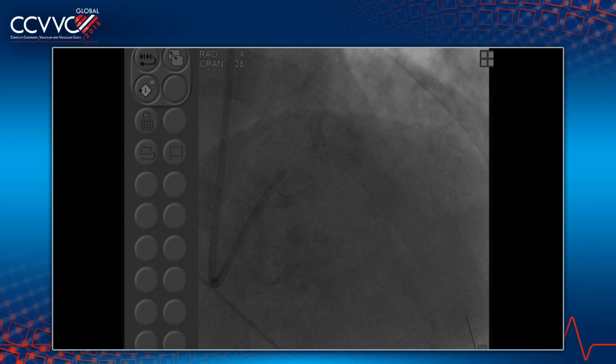And usually in the left main, we will say when you want to post dilate, go with your NC balloons. Any other comments about the case, Eberhard? Would you do anything differently, or would you like the mini crush, Dr. Colombo? No, I think very good.